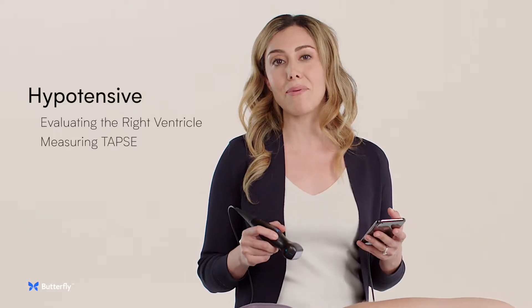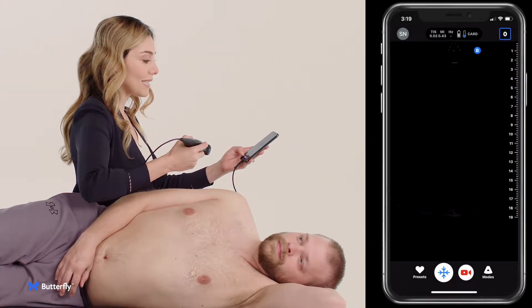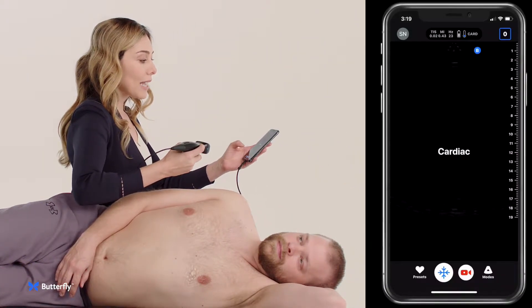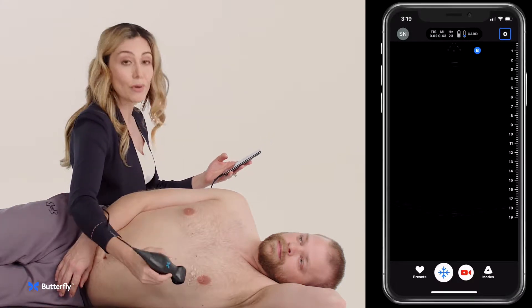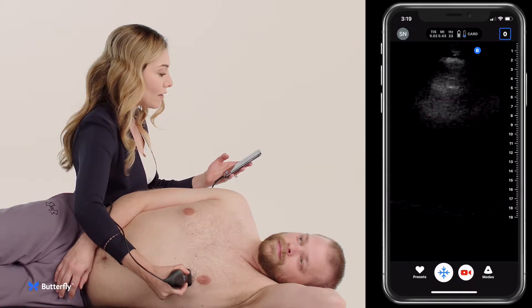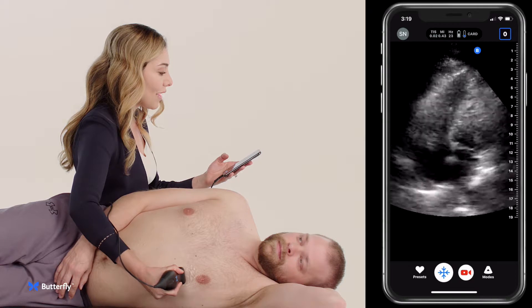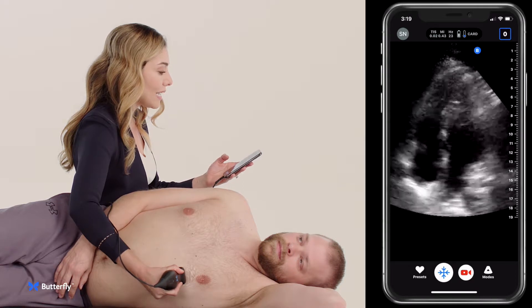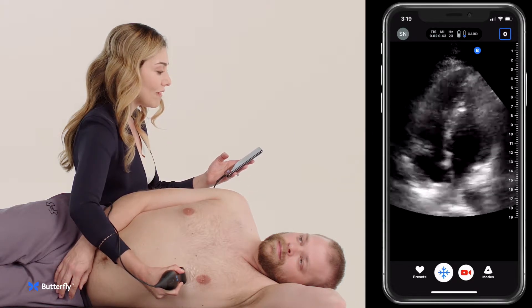An evaluation of the RV is extremely important for my practice. One of the best ways to do this is to go to the presets and select cardiac. Once you're in the cardiac preset, you can go to the apical four-chamber view, where you put the probe where you think the point of maximal impulse is on the chest, and you're able to get the right ventricle next to the left ventricle and really evaluate RV function.